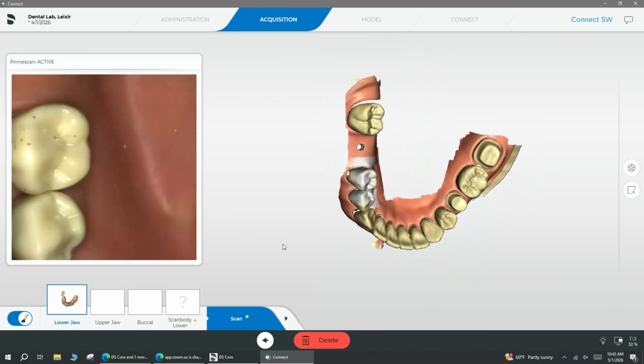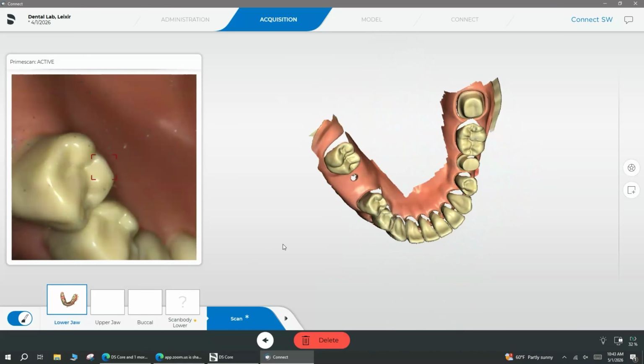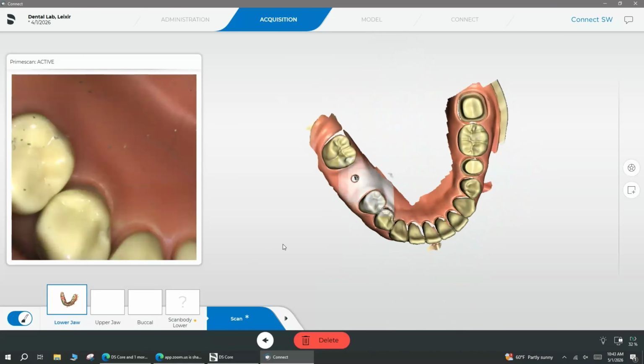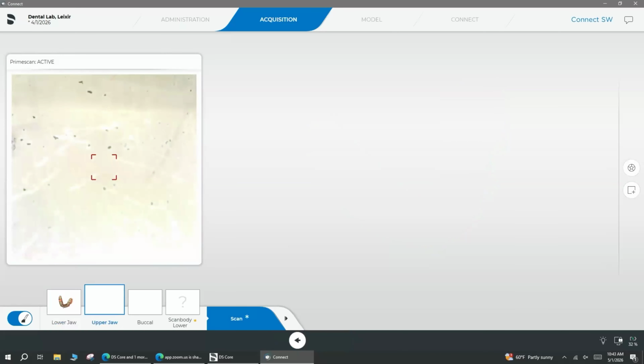I'll get my contacts really good. We can do our upper jaw.